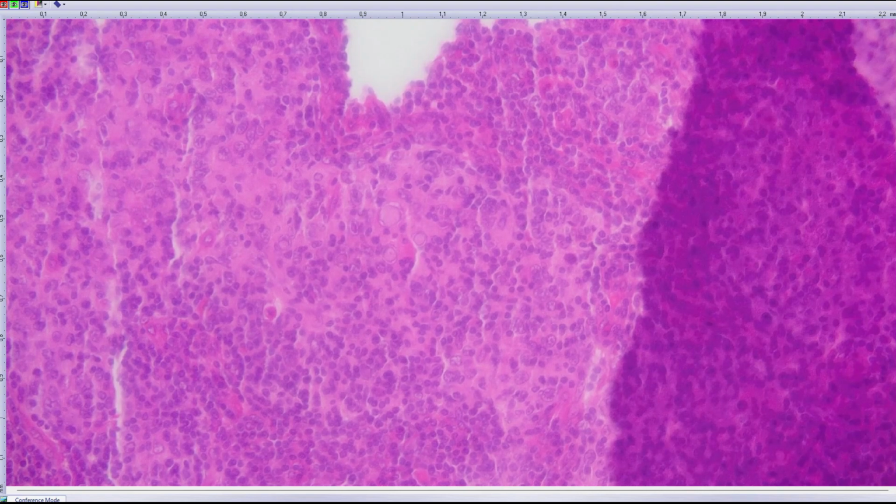And this paraprotein, we found that the plasmacytic proliferation in this case had monoclonal restriction. It was lambda positive. It's quite often seen in follicular dendritic cell sarcoma that there is some lymphoid proliferation in addition to this malignant lesion.